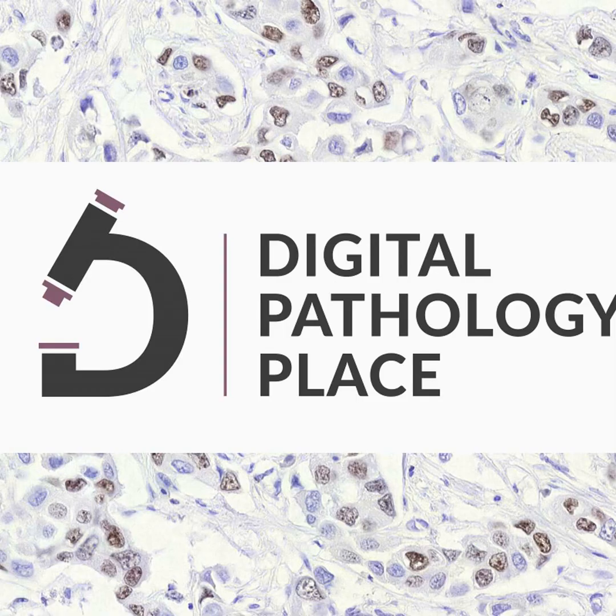And I think that's also the main reason that histology still has a very classic approach: look at the image and have the highly trained expert extract the embedded information, which I think still works very well on, let's say, the classic H&E stain, or, as you said, the Brightfield, the Multiplex. But as soon as you go to high dimensional data, you get this high dimensionality component on top, which means we add a lot of channels.